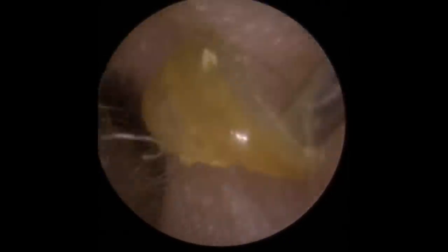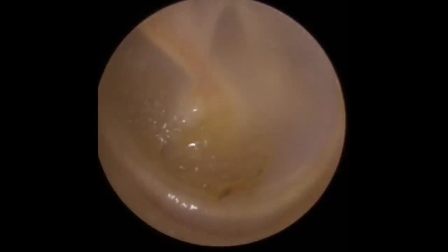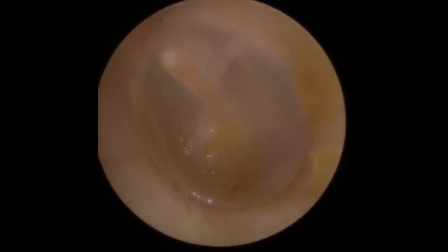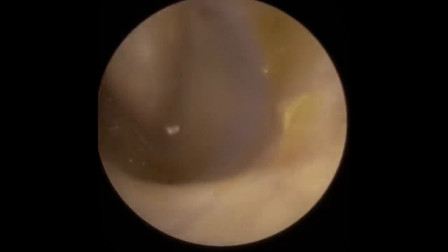So you can see it's so thin, almost paper thin, a little piece that's just been sitting against the right hand side. But you can see there's a little bit of a ripple effect to the left hand side at the base of the drum there. That's the remainder of this thin plate of wax. So we're just going to very gently work our way down to that now. So just ever so gently, very slowly working our way down.